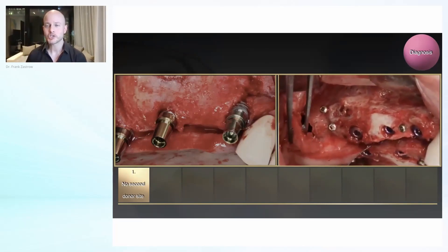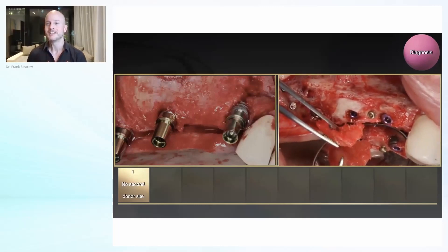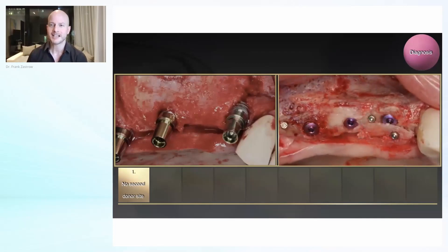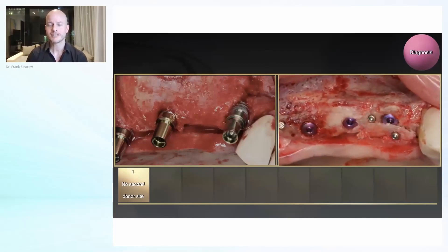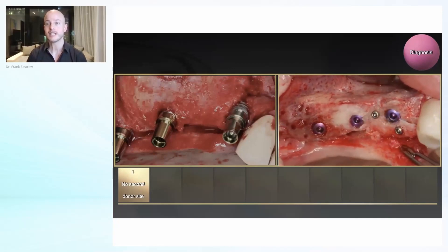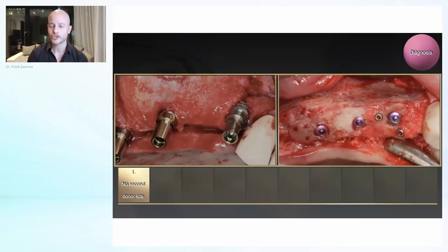Recently on social media I saw a nice expression — it was called the Robin Hood technique: taking from the rich side and giving it to the poor side. This is something to always keep in mind, and you can even reuse the screws, as you see here. We now have the implant surrounded with a lot of autogenous bone.